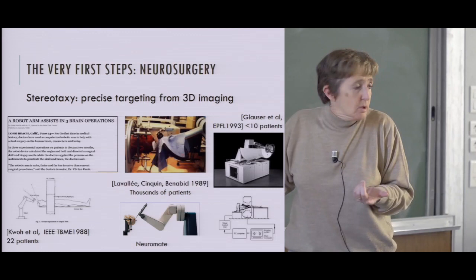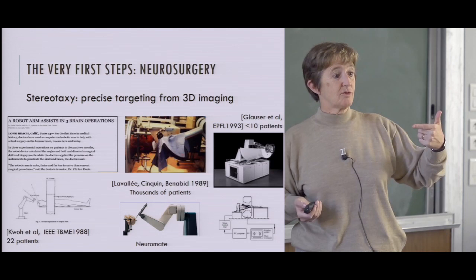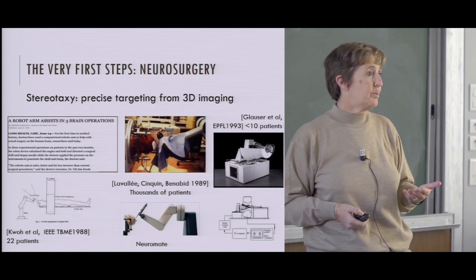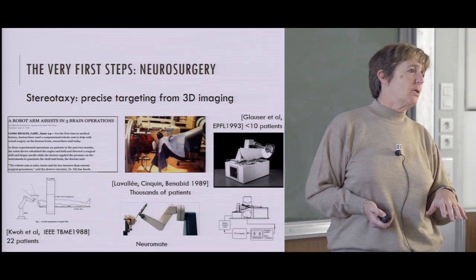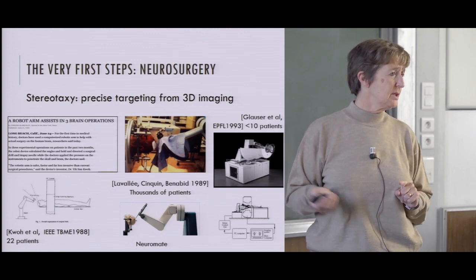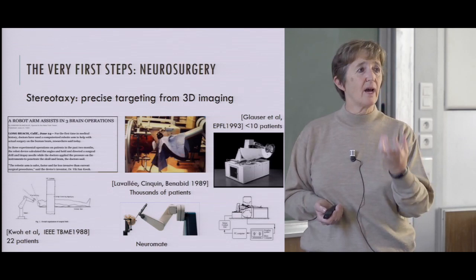So, okay, it's a choice, but you can imagine that in this case, safety issues are much bigger, because if the robot has to drill the skull, it has to stop just before getting to the surface of the brain. So you need to develop really force sensing and very precise control so that you stop at the right moment. And we thought that in our case it was not really interesting to do that because it's something that the clinician is perfectly able to do by himself. What is difficult in that application for the clinician is to drill at the right position. So it's really a positional aspect which is interesting, not a tactile or a gesture thing.